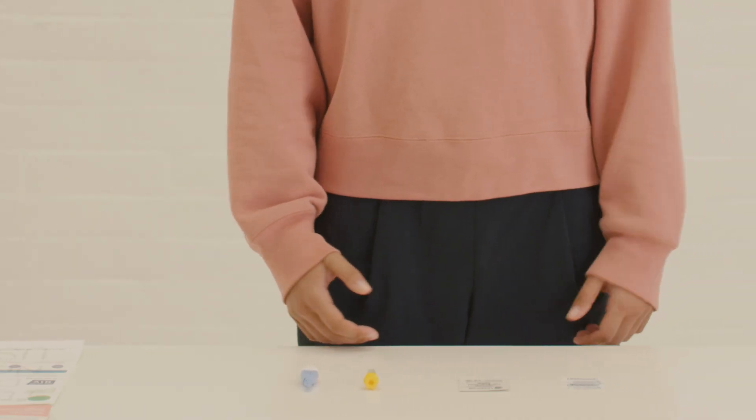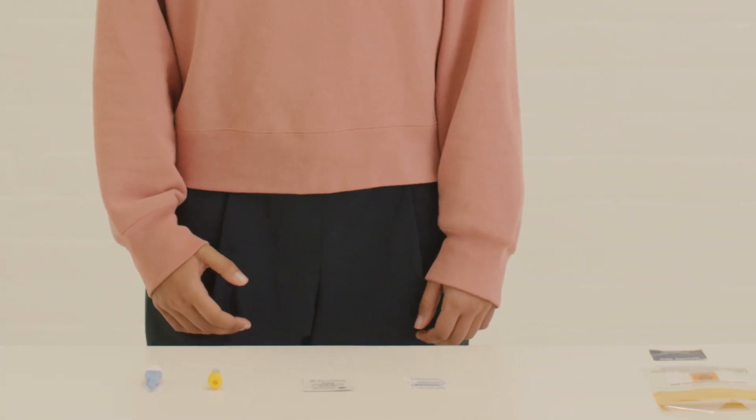Find a clean flat surface and lay the test kit out. Keep standing up with your hand below your waist. Remove the lid from the blood tube and place the tube on a flat surface so it can stand up.